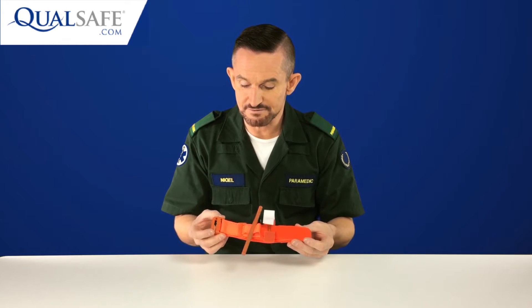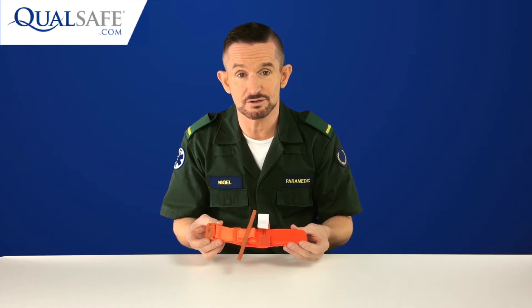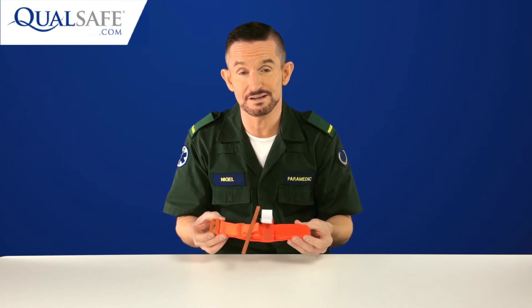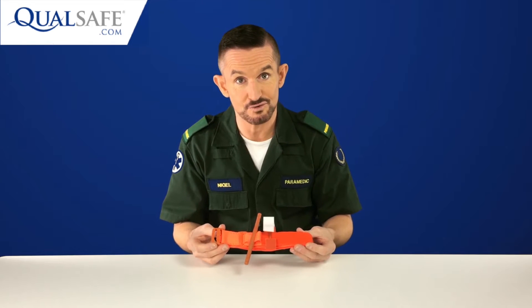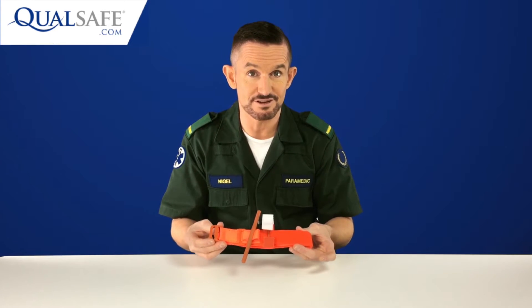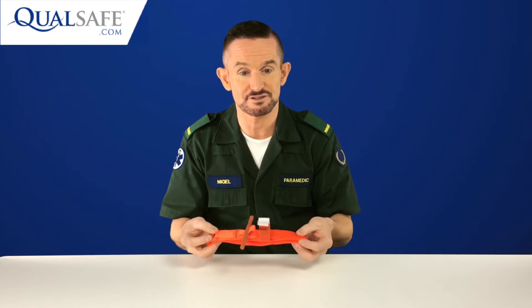All the manufactured tourniquets do come available in combat colours, but a black colour or a colour that doesn't stand out on your patient is not what we need for the civilian setting. The last thing we want is a doctor or a clinician further down the line not realising that there's a tourniquet applied. It needs to be obvious that there's a tourniquet on this patient's arm or leg. So bright orange is perfect for civilian use.